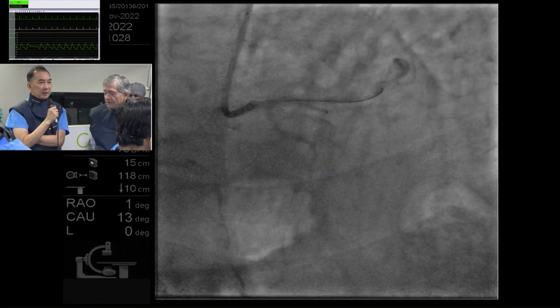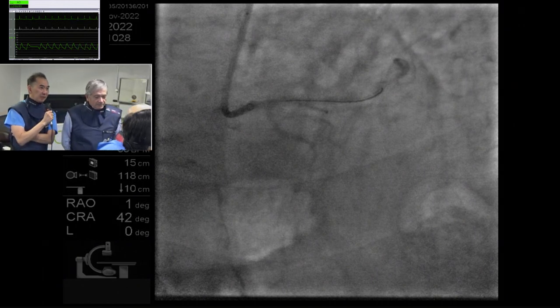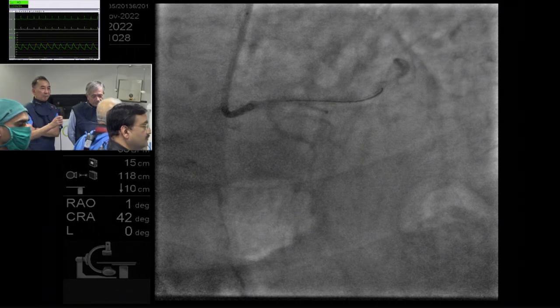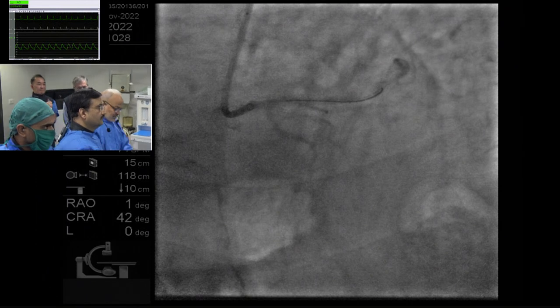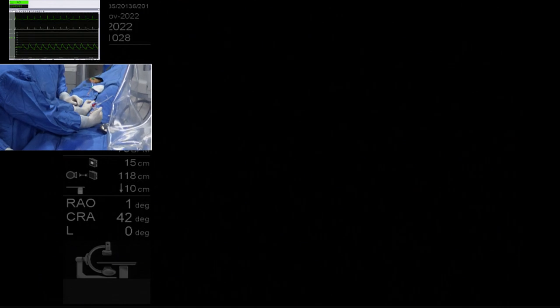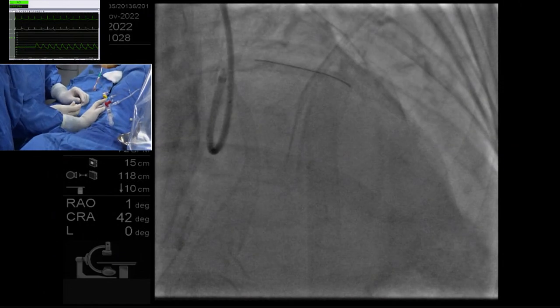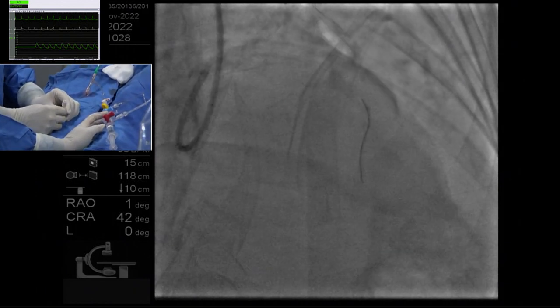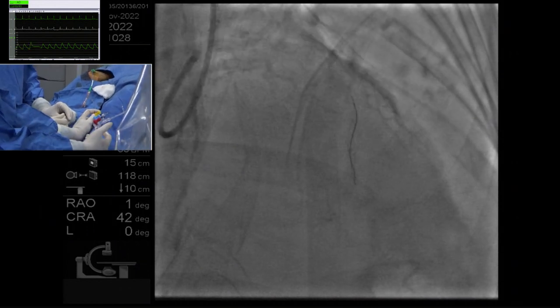Yes. You want to make sure you crack before you're using IVL, or you go to IVL? Yeah, because I want the best possible minimal stent area in this patient. Because my stent, I am sure, even the proximal and distal edge is going to be inside the calcium. And there is a 10% chance that most of the calcium, as we have seen in some of the cases over here, may be in the adventitia, but chances are less. Here I am expecting 360 degrees at many places.